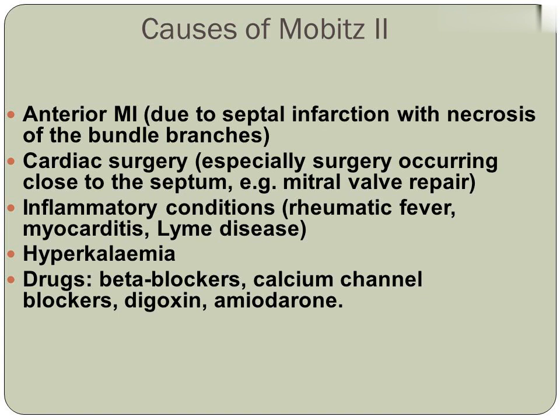In around 75% of cases, the conduction block is located distal to the bundle of His, producing broad QRS complexes. In the remaining 25% of cases, the conduction block is located within the His bundle itself, producing narrow QRS complexes. Unlike Mobitz I, which is produced by progressive fatigue of the AV nodal cells, Mobitz 2 is an all-or-nothing phenomenon whereby the His-Purkinje cells suddenly and unexpectedly fail to conduct a supraventricular impulse. There may be no pattern to the conduction blockade, or alternatively there may be a fixed relationship between the P waves and QRS complexes, for example 2-to-1 block, 3-to-1 block.